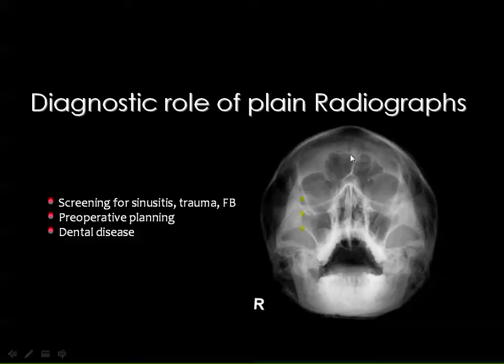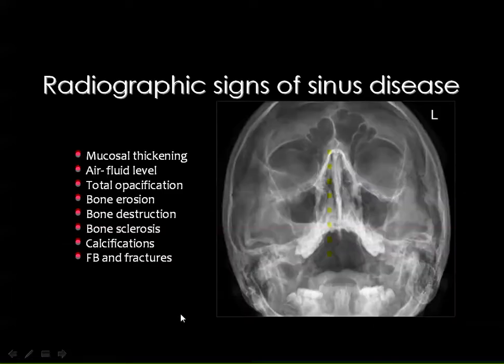or maxillofacial foreign bodies in cases of trauma, preoperative planning, and it was sometimes helpful in assessment of dental disease.